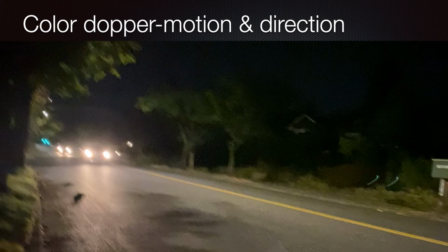Next, we're going to talk about color Doppler, motion and direction. And here you can see some cars going by me on a street, and you'll notice that the frequency of sound is high and then it becomes low.